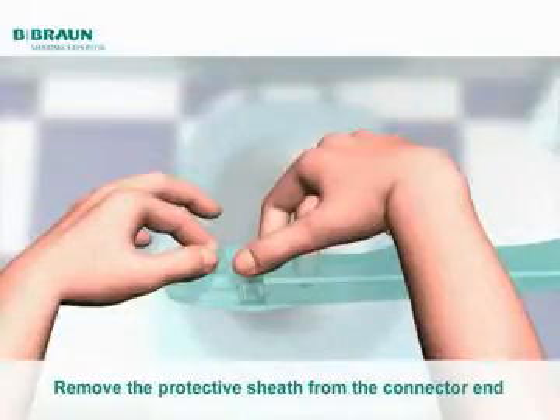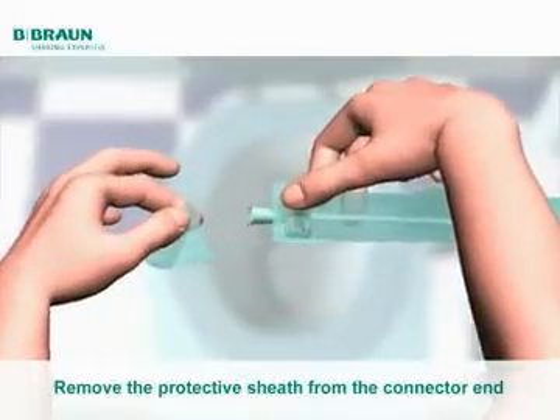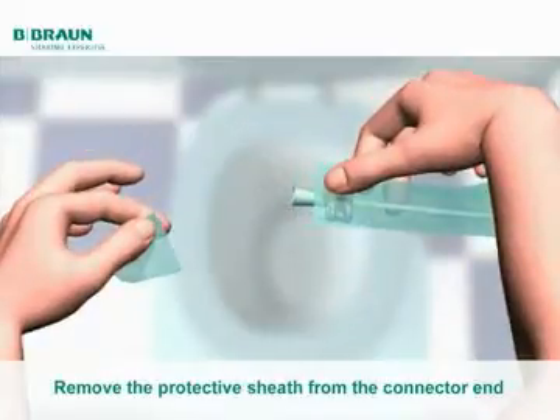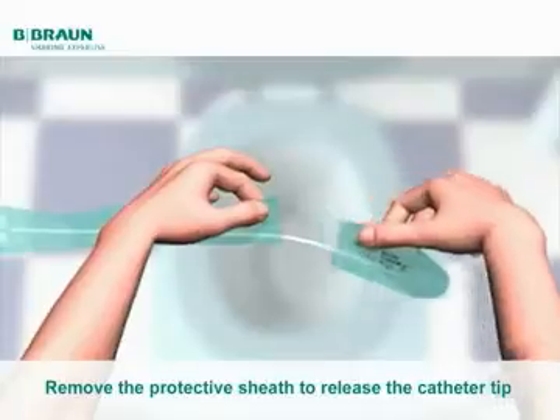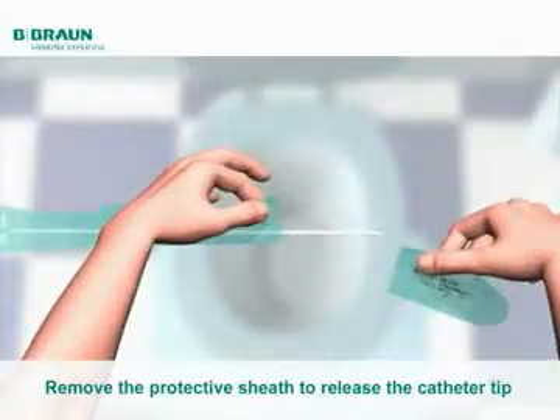In order to remove the protective sheath from the connector end, grip the sheath between your thumb and forefinger at mark 1 and tear off to release the connector. To release the catheter tip, grip the sheath between your thumb and forefinger at mark A and tear off. 10 cm of the catheter will now be released for entry into the urethra.